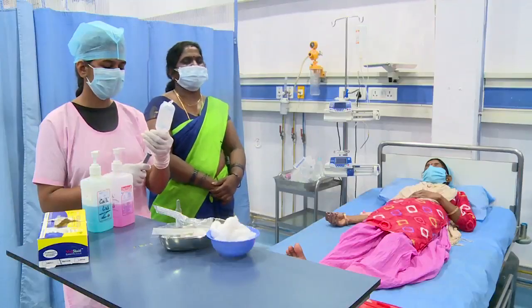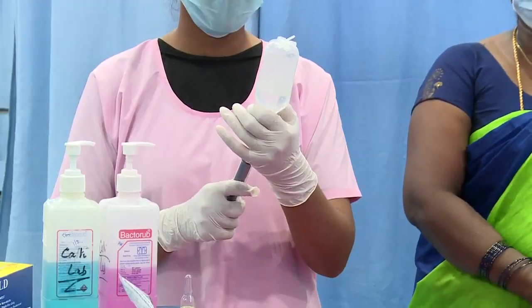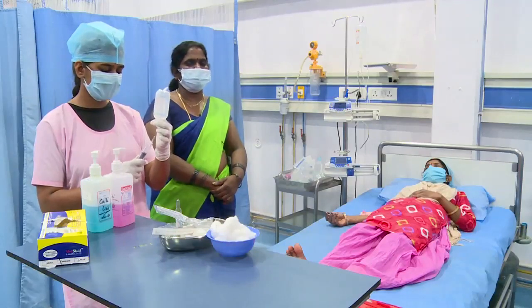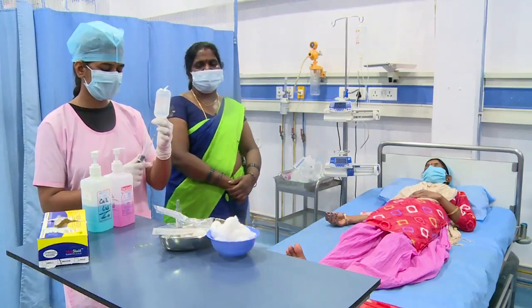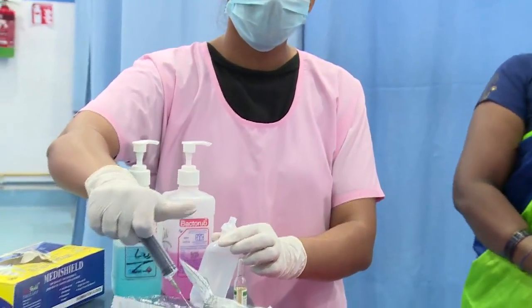So now we are going to administer 10 ml of calcium gluconate in 100 ml of dextrose. She is withdrawing 10 ml of solution from the dextrose and discarding it in the kidney tray.